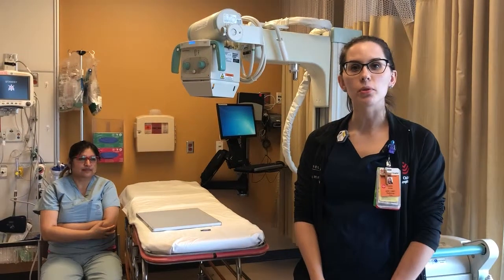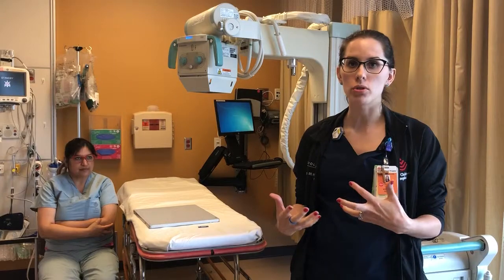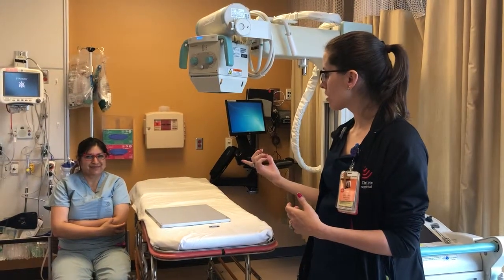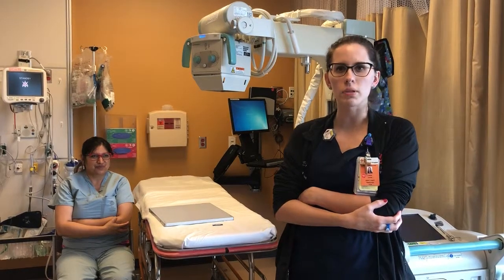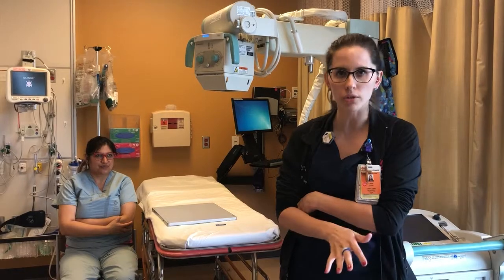In this video series, we're going to discuss how to position forearm radiographs, and I'll tell you my approach to a patient, and this is our patient here, our wonderful volunteer. As you can see, she's already in a guarded position for her arm, so she's already done half the work for you to start out with.